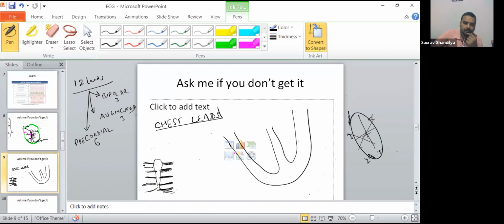How do you find intercostal spaces in general? You go to the manubrium sterni, right? Then you go a little downward, and you find there is an angular prominence here. What you call the angle of sternum, right? From there, if you take a right or left turn, you find the second rib. Correct or not? Nobody's answering, I think you are sleepy now. Just descending from the second rib, you have the second intercostal space. Now you count second intercostal space, third intercostal space, fourth intercostal space.